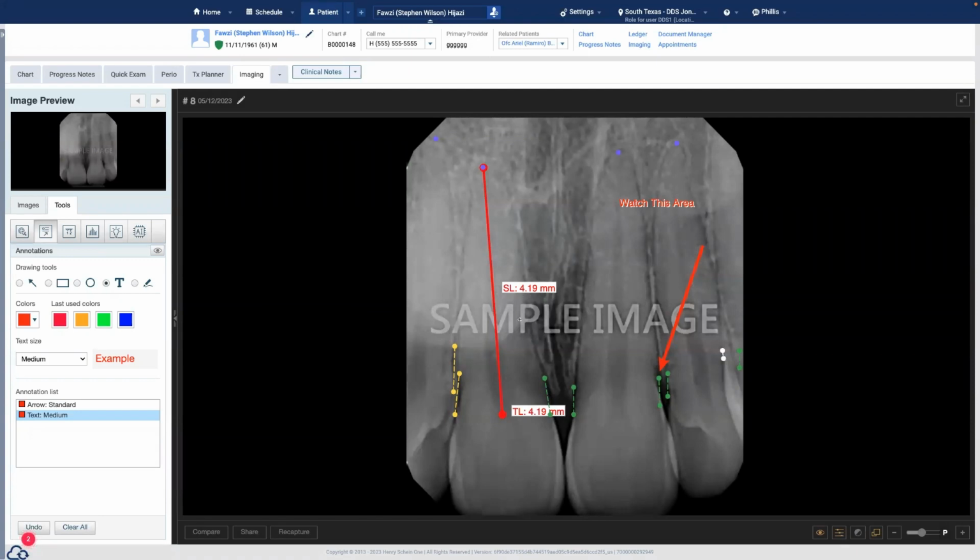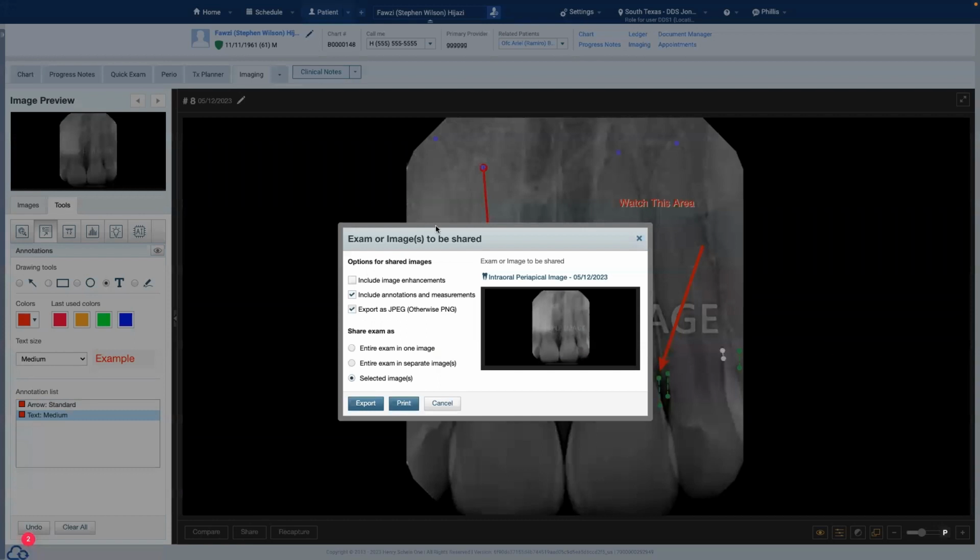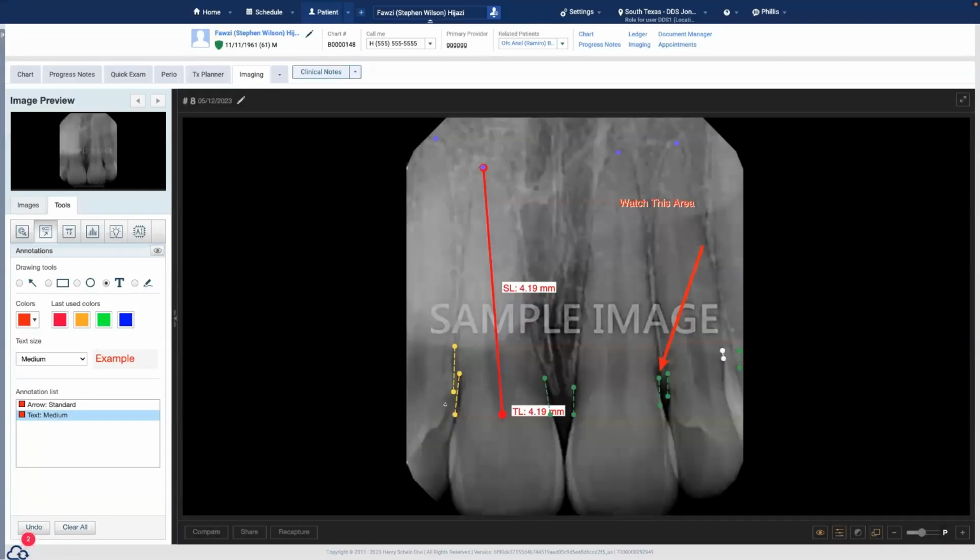I talked to a doctor just last week about Dentrix Ascend imaging, and they share these images with the patient and send them home with the patient. So the patient can then talk about treatment options and say, here are the radiographs that the doctor showed me, so that it can help with the treatment plan and treatment plan acceptance.